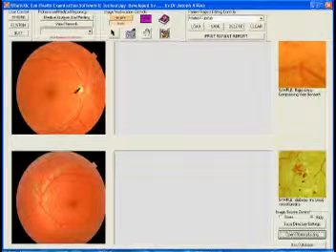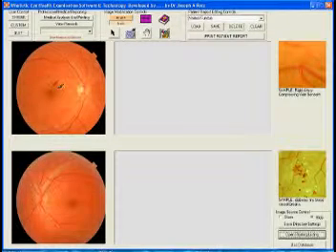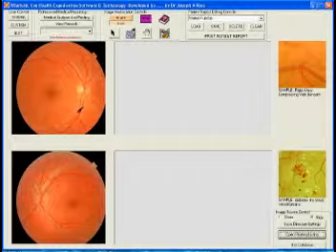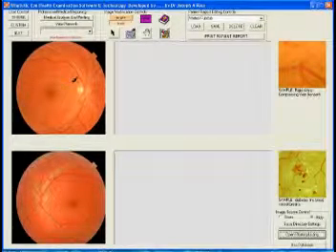And in this case, we're going to mark things on this picture for display that are not actually there, just so I can show you what the tools do. Because this patient happens to be pretty healthy, other than for some small drusen. Now, one of the things you'll notice is that if you look at this picture, you don't see drusen. If you look with your handheld instrument, you'll see pretty much this. So you won't see drusen. But this is the advantage of using the digital retinal imager.